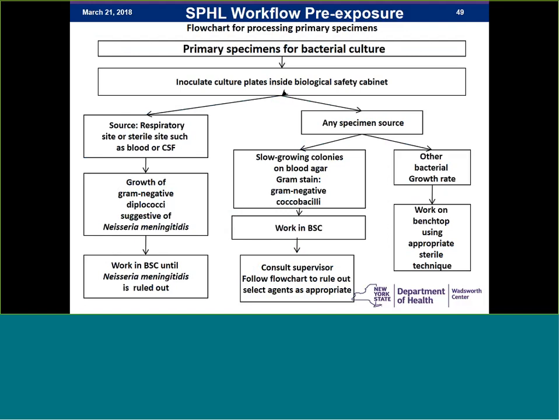After this event and reviewing the rule-out algorithm, we realized that the current algorithm was overly complex and did not place enough emphasis on the gram stain results and organism growth rates. The algorithm originally listed all the expected reactions for all select agents and did not specify the key tests that should have been highlighted. This was also an indicator that we needed to spend time retraining individuals on the algorithm.